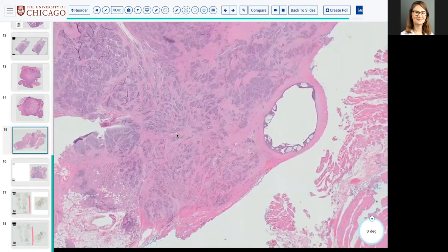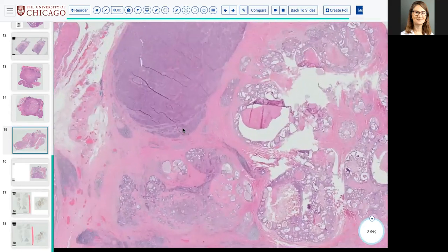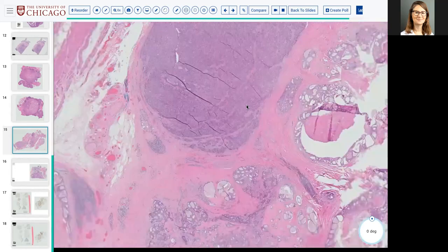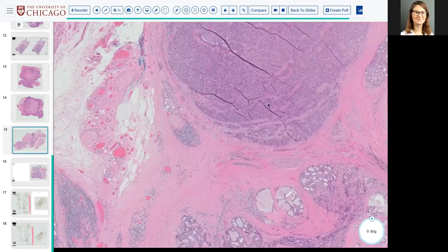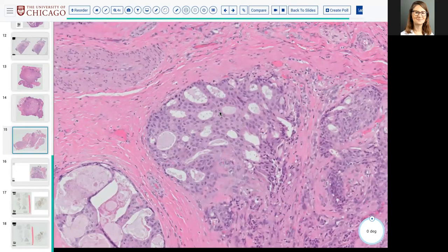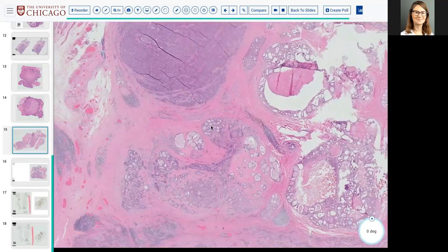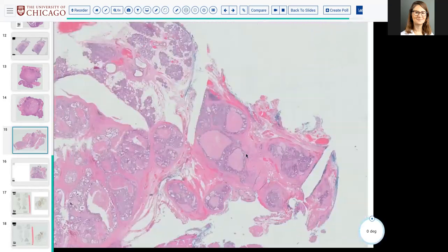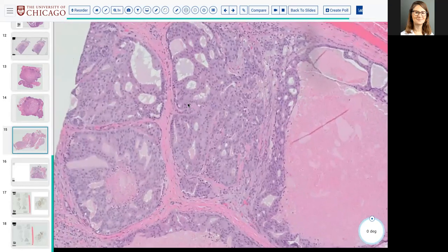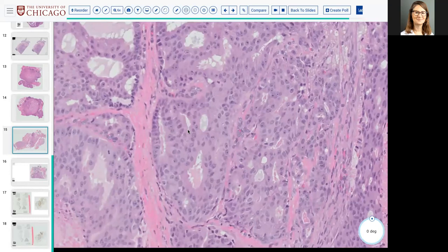So somebody had mentioned androgen receptor earlier. I would argue that there are some cases of high-grade salivary carcinomas that are androgen receptor and HER2 positive, but mostly androgen receptor and HER2 are restricted to this, right, which is salivary duct. It's important to determine the status of these tumors because they can use androgen blockade or Herceptin to treat these. So that is one of the stains we often get asked to order, androgen receptor and HER2, because they are targetable. And they are present in very rare examples of high-grade non-salivary duct cancer.